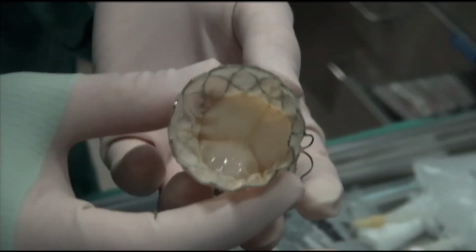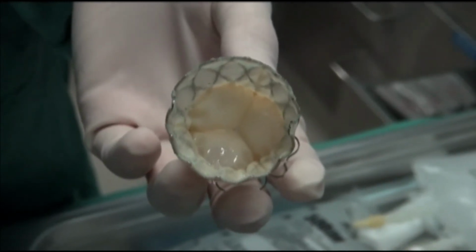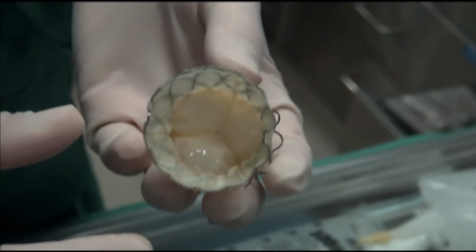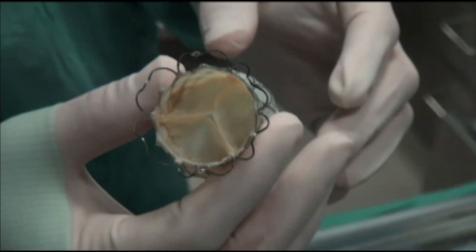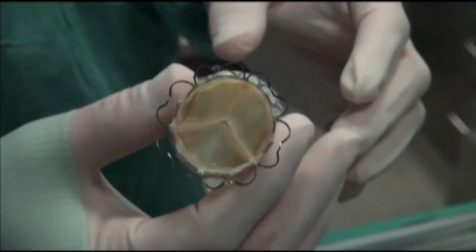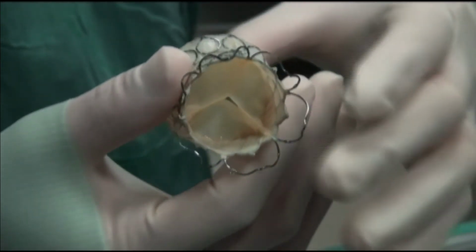So now this is the short axis view from the RVOT. You can see there are 3 cusps. Now we will change to the view from the top, from the PA bifurcation, looking down, and you can see the 3 cusps also. And at the top, the flare is uncovered, so the blood flow can go into the RPA and LPA also.